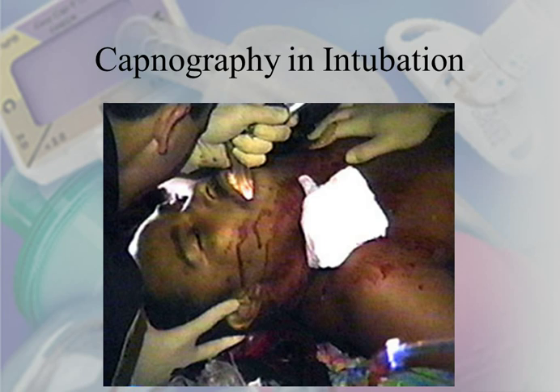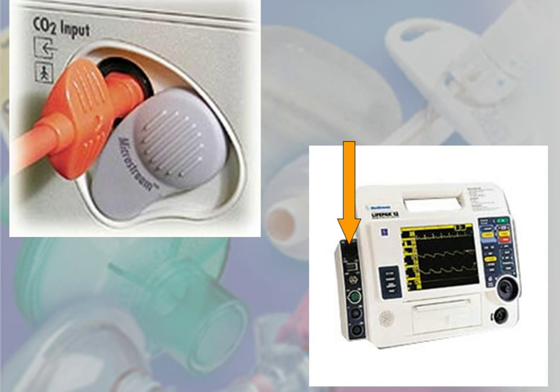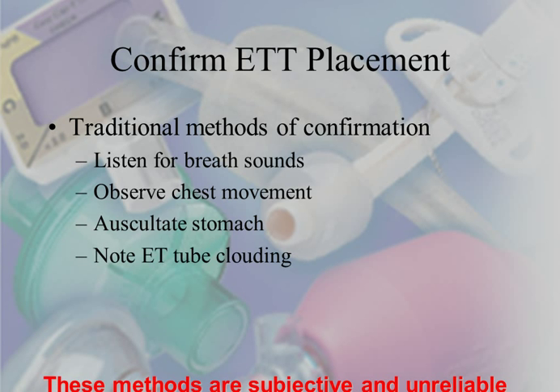All right, so using capnography in the intubated patient, or when we're intubating, or after we've intubated. So that's where we hook it up onto our LifePak 12 or our 15. Doesn't matter which one, but that's where we hook it up to. This is when we're using the filter line.